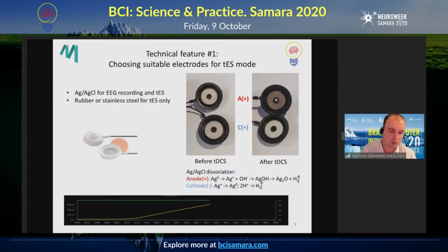You need to use either very small currents of microamperes, 100, 200, up to 500, and then it will be below. There will be oxidation, of course, if you use the same electrode, but the overall lifetime of the electrode will go up.